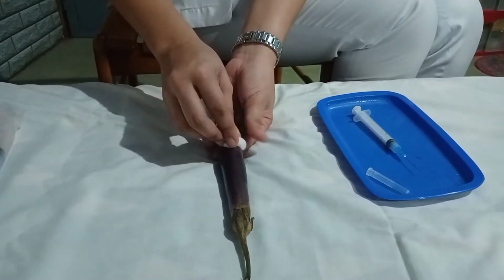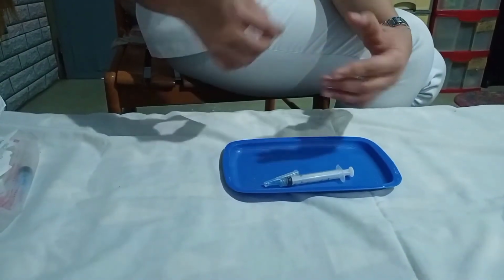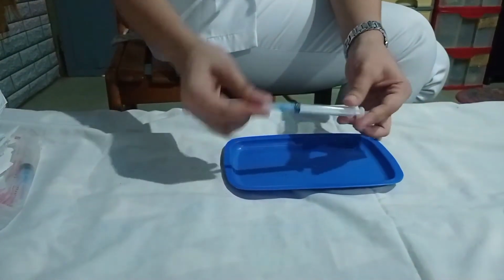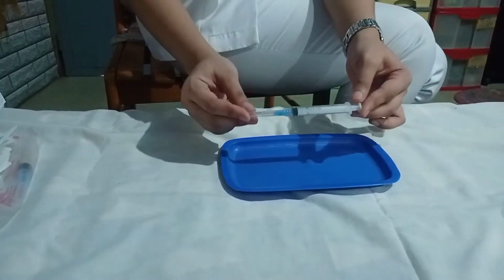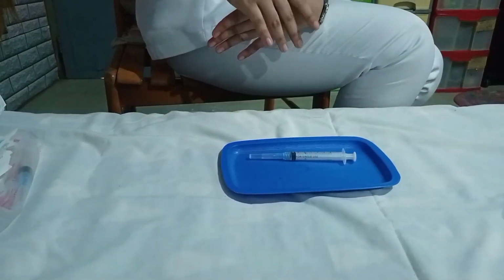After that, cover the injected area with a cotton. After, discard the equipment, needles, and sharps in designated containers. Put it in a proper trash so no one could be hurt by it. The rationale for this is to protect the nurse and others from injury and contamination.